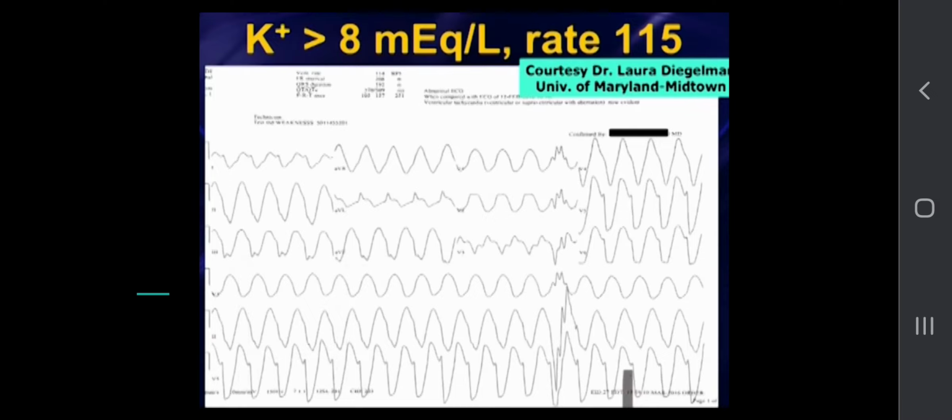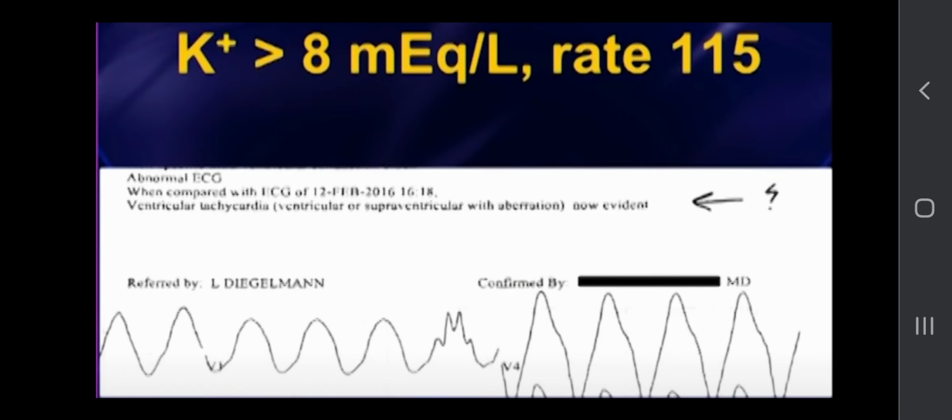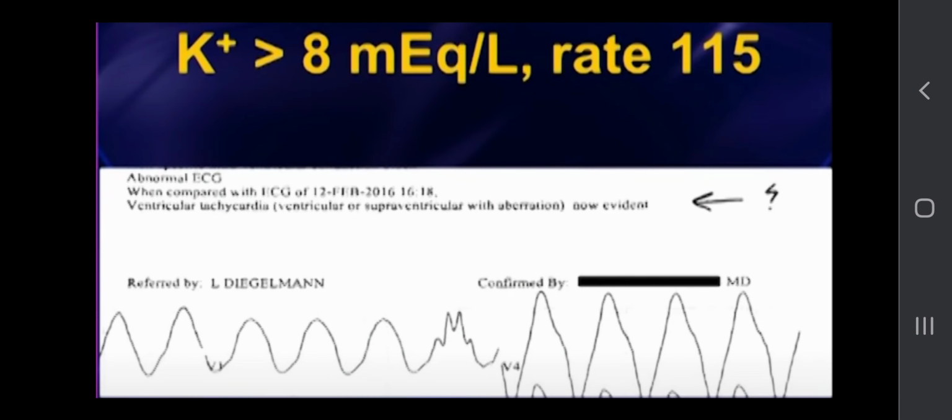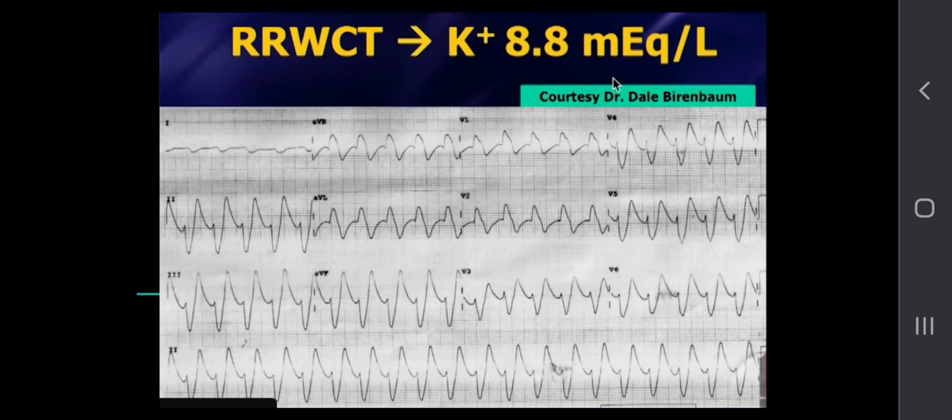And I zoomed in on a part here. If you zoom in, you've got the monitor reading here of ventricular tachycardia. Now, if you follow the monitor's interpretation of this rhythm, you will kill this patient. So be diligent and know how to read your EKGs.